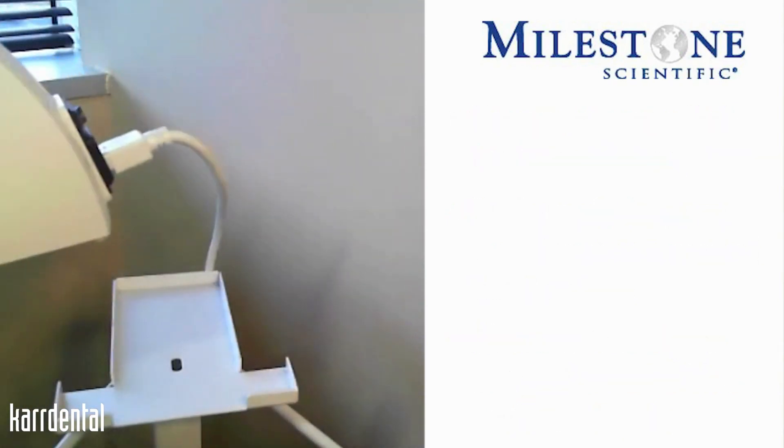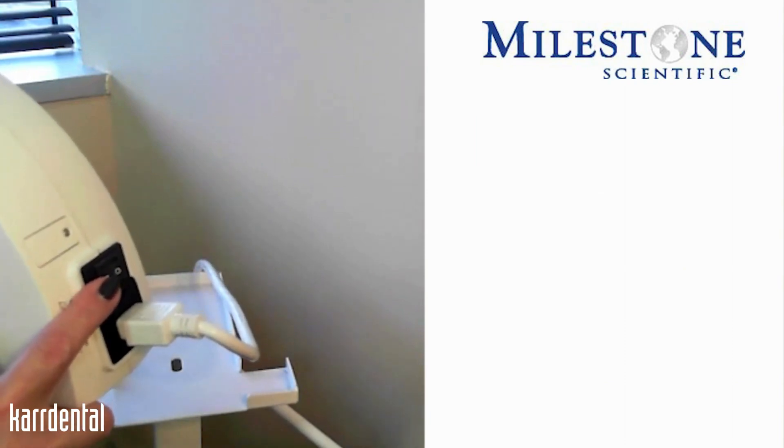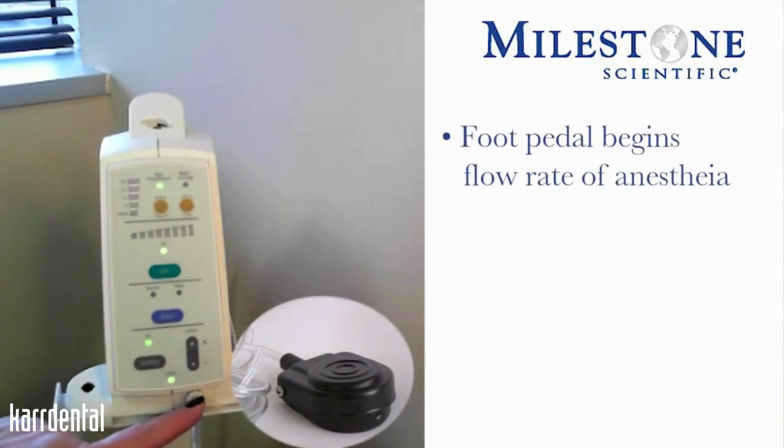The STA single tooth anesthesia system — the plug gets attached to the back of the instrument, and there is a power switch in the back. The foot pedal will get attached just below the volume indicator, and that foot pedal is now going to be the way that you will begin your flow rates of anesthesia.